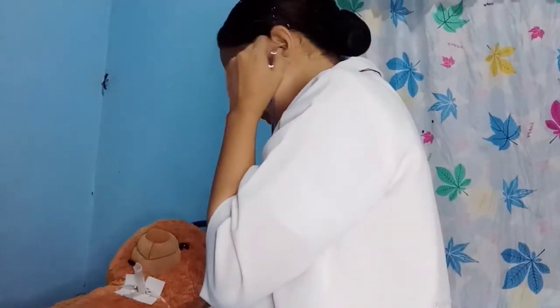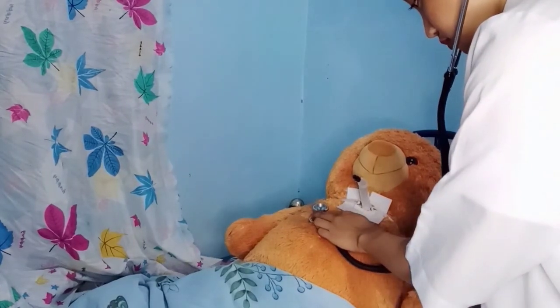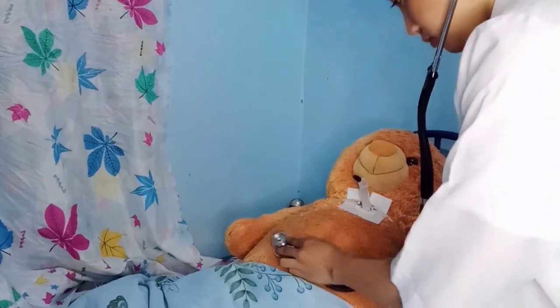Next is documentation. Document what was assessed during the tracheostomy care. After that, re-assess the patient's respiratory status, including respiratory rate, effort, oxygen saturation, and lung sounds. Auscultate the patient again and check their lung sounds.